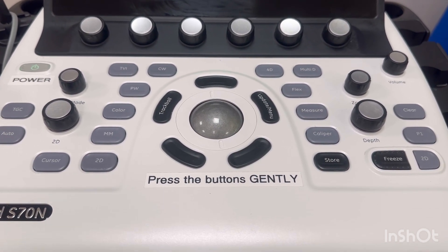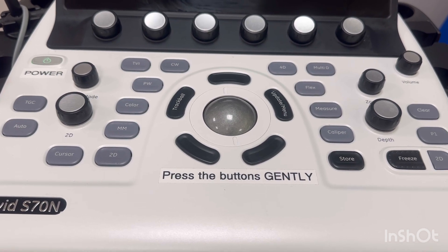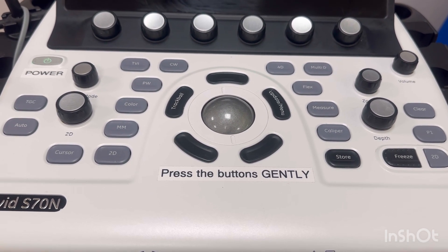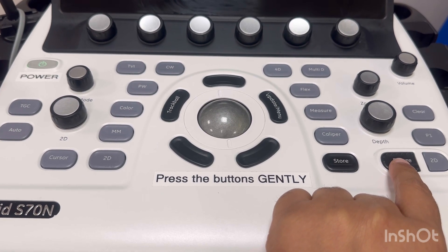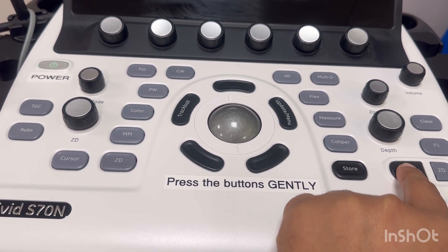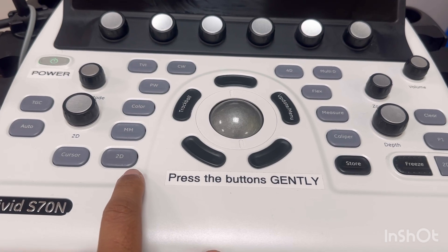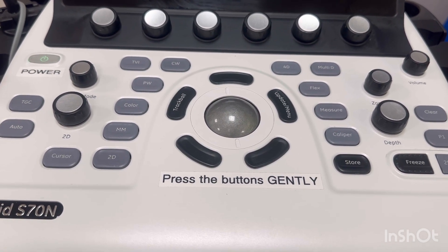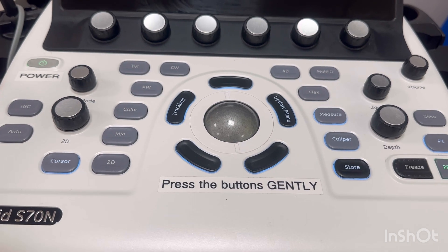Once you are ready with your image — your arm is still, the image is not moving with breathing — you don't need a perfectly foreshortened apex view; you mainly need good atrial visualization. When you're ready, tell the nurse, who will have already placed the IV line and prepared the agitated saline. Once you say 'I'm ready, please inject,' there should be proper communication between you and the nurse. As they are about to inject, you press freeze and then unfreeze.